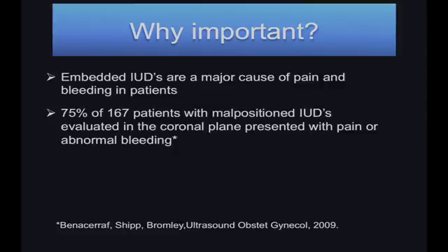So why is this important? Well, embedded IUDs are a major cause of pain and bleeding in patients. And Beryl Benacerraf and her group looked at 167 patients with malpositioned IUDs and found that 75% of these patients presented with pain or abnormal bleeding.